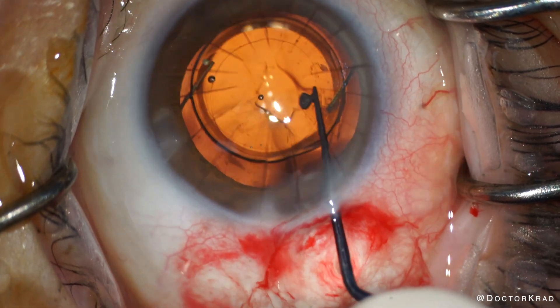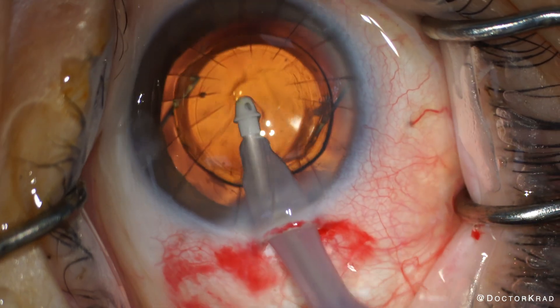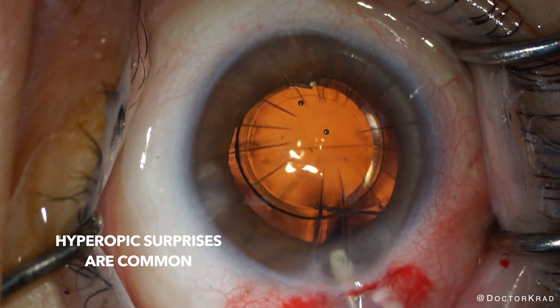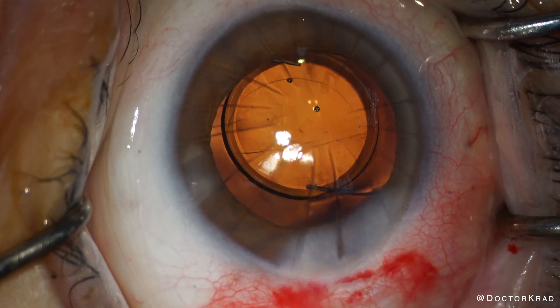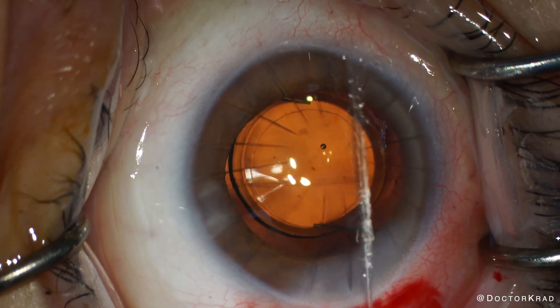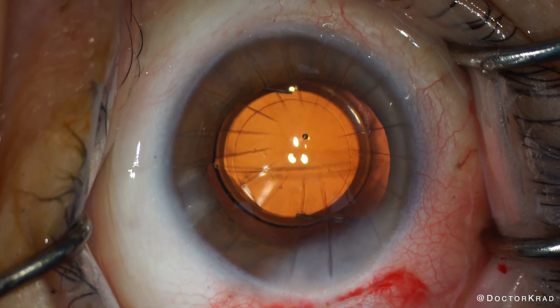And thank goodness we did, because despite performing multiple tests prior to surgery, including topography with consistent readings, we had a significant refractive surprise. Refractive surprises are much more common with 16-cut compared to 4- or 8-cut RK. In my experience, I've found hyperopic surprises post-16-cut RK. So expecting a hyperopic result, I aimed for minus 2. A few weeks after surgery, they were close to plus 2.5. With the light adjustable lens, we can knock out most or all of that residual refractive error, whereas with the Apthera we wouldn't be able to. We're going to wait longer than the minimum 17 days to perform light adjustments — we really want to make sure the residual refractive error is stable.